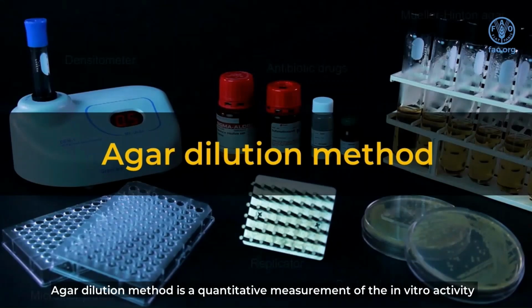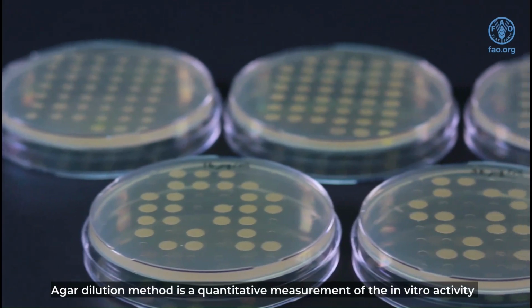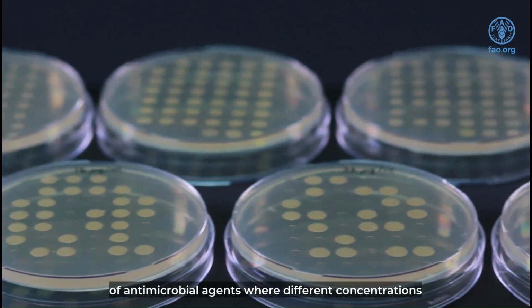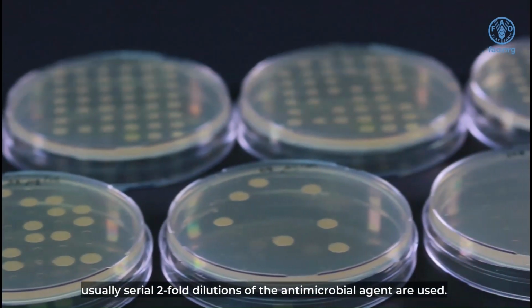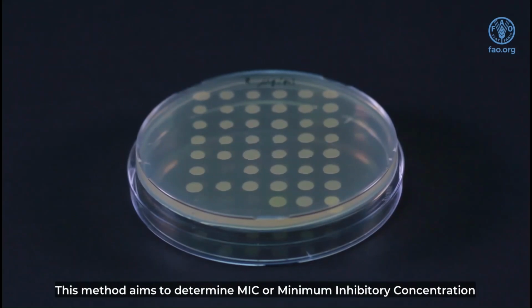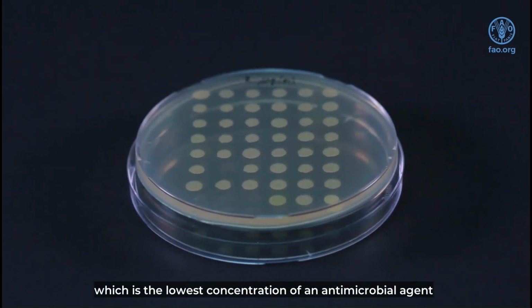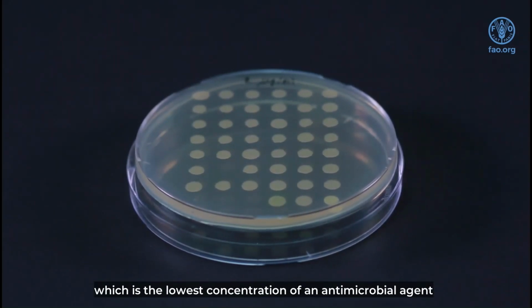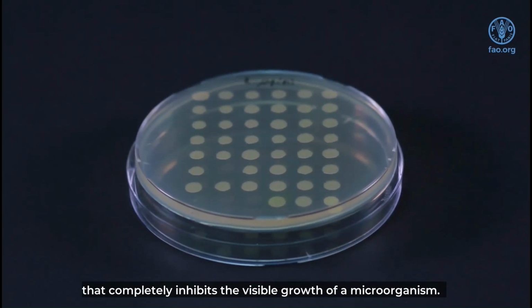Agar dilution method is a quantitative measurement of the in vitro activity of antimicrobial agents, where different concentrations, usually serial twofold dilutions, of the antimicrobial agents are used. This method aims to determine MIC, or minimum inhibitory concentration, which is the lowest concentration of an antimicrobial agent that completely inhibits the visible growth of a microorganism.